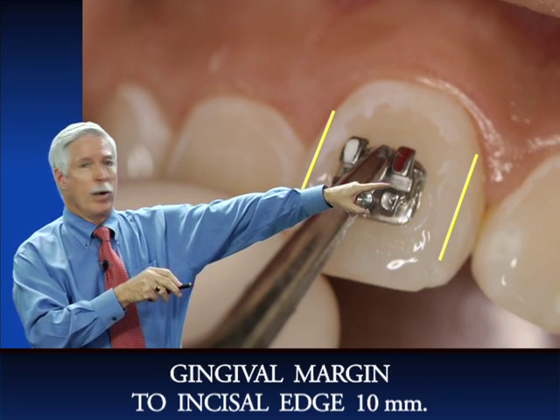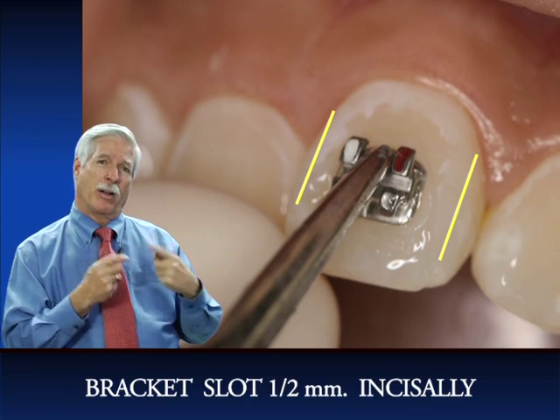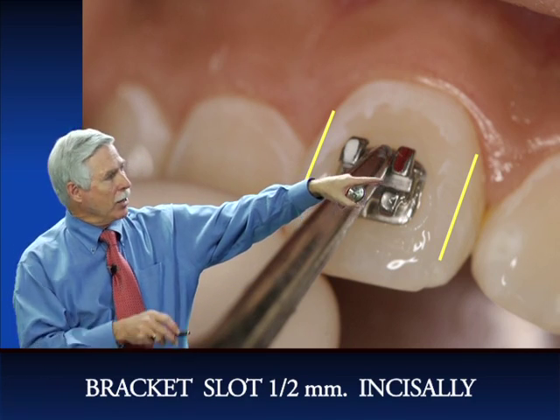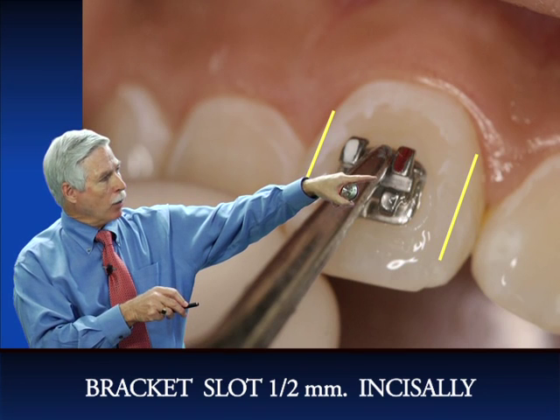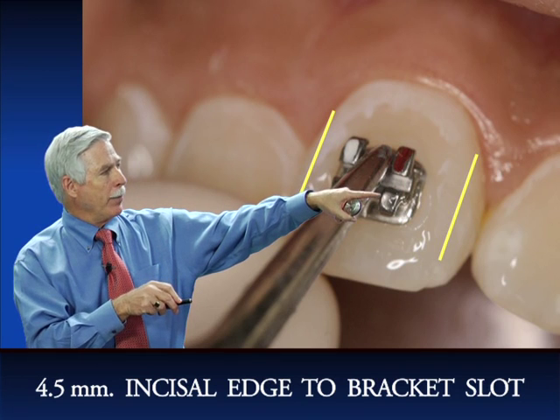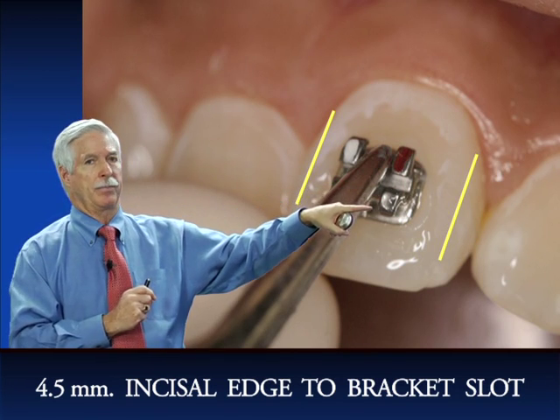We find the midpoint, which is 5. So the midpoint is 5. We place the bracket on the central incisor ½ millimeter incisally. So if 5 is the midpoint, we move the bracket down ½ millimeter, and therefore it would be 4.5 millimeters from the incisal edge to the slot.